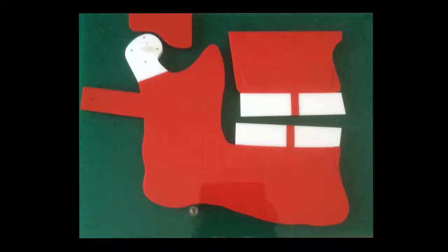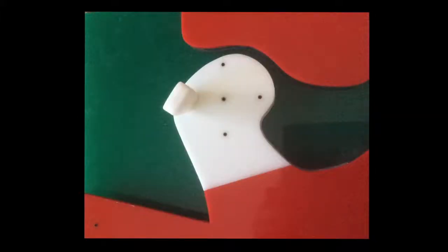He had a series of slides on where the theoretical arbitrary axis was supposed to be and where it really was, and they were often at least a quarter of an inch apart. His model is mathematically accurate to demonstrate the error which occurs when there is a quarter of an inch of error between the real axis and the facebow transfer from an earbow. It is instructive to see what type of error occurs when one is just a quarter of an inch off from the true axis.